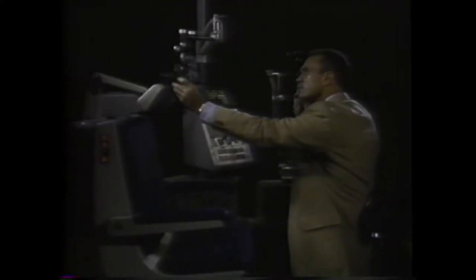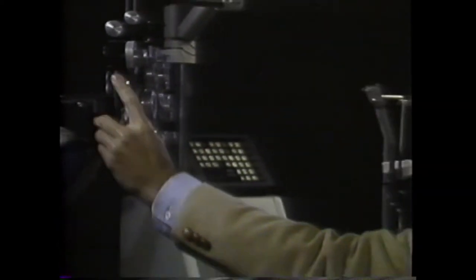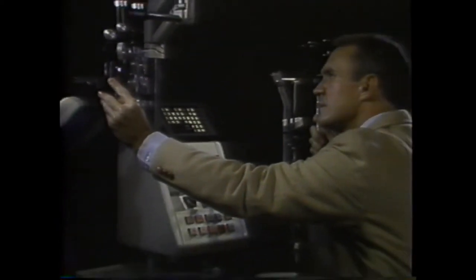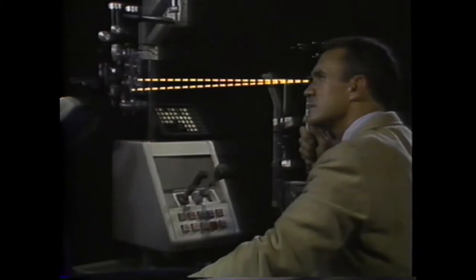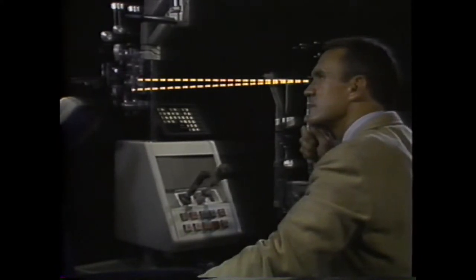So far, the examiner has remained at the normal working distance and has moved the far point about by changing the lenses in front of the eye. Once the far point is in the vicinity of the retinoscope, however, the zone of neutralization can be examined very precisely by moving forward and backward.